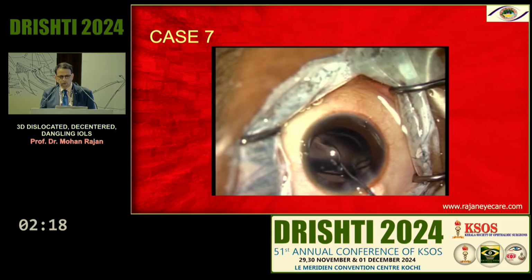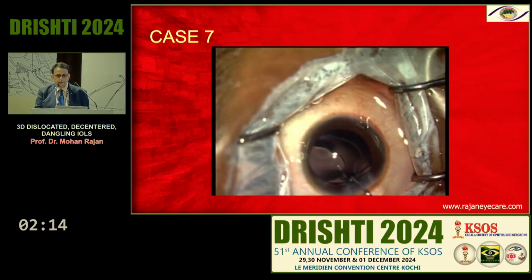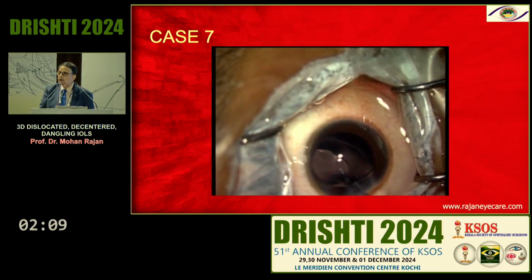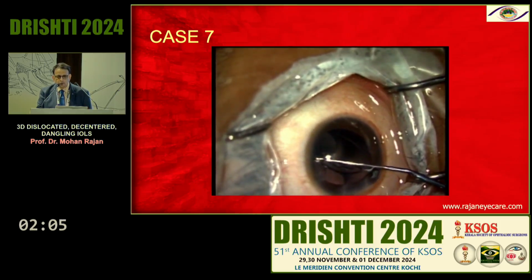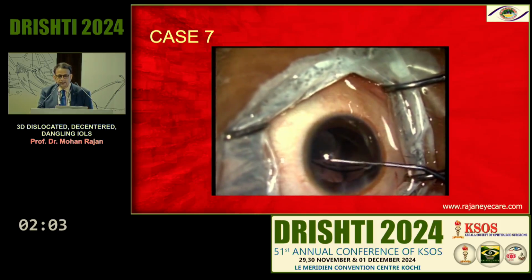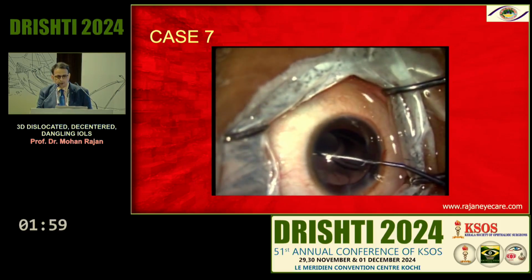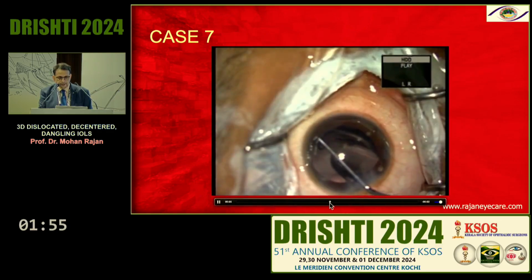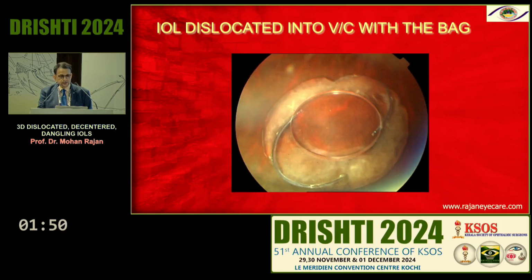This is a young patient, traumatic cataract, and you can see here they opened up, and the PC opened up, the lens started going into the vitreous. Immediately what I did was what is called the AAL, anterior assisted levitation. So I go through the side port and bring that lens up, and this is a Supraphob lens. It does not have thick haptics like the Alcon SA60. So I just brought the lens up and then put this lens into the sulcus, and the patient is doing well.